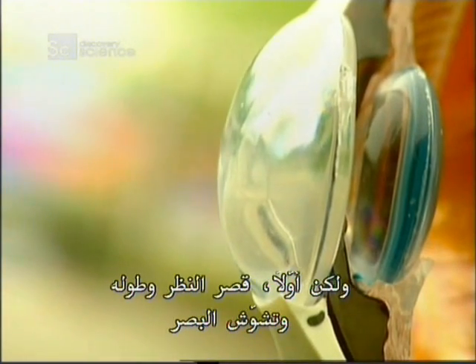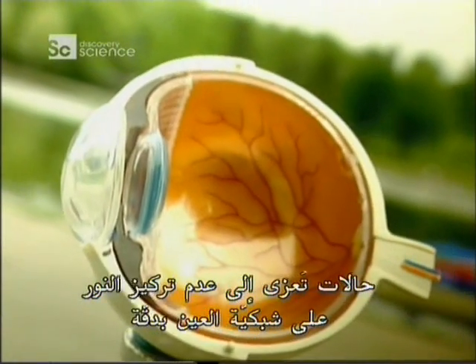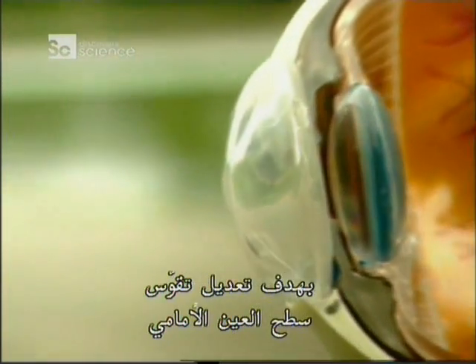But first: short and long-sightedness and astigmatism are all due to light not focusing precisely onto the retina. Surgeons can correct this by using a laser to reshape the curvature of the front surface of the eye.